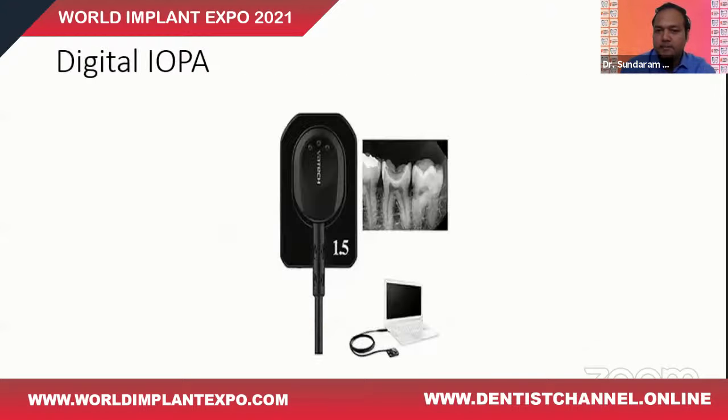And now this is the advancement of the conventional radiograph, wherein the film is replaced by an electronic sensor, as you all would know, because these are most commonly available these days in each dental clinic. Once the X-ray is taken, the sensor is connected to the computer display monitor. Once the X-ray source emits the X-ray, you get the image formatted in the display, which is really very convenient because it reduces the work time of the dentist who wants to diagnose what is inside the jaws of the patient.